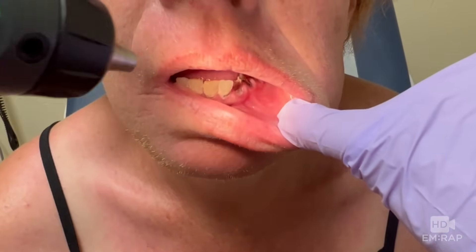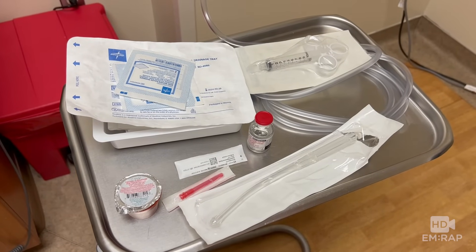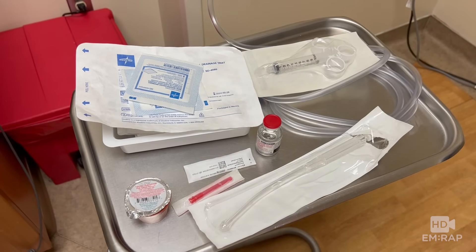I'm Dr. Jess Mason, and this is one of my patients who we found to have facial swelling and a gingival abscess. So we're going to drain it. In addition to a standard IND kit, we have a control syringe, 27-gauge needle, viscous lidocaine, lidocaine with epinephrine, and suction.